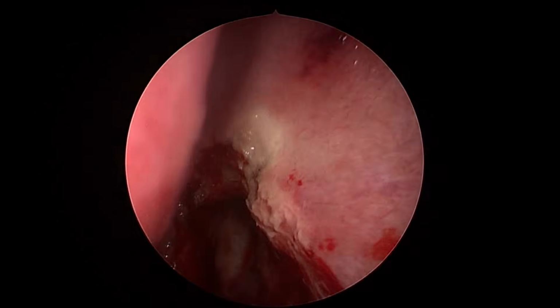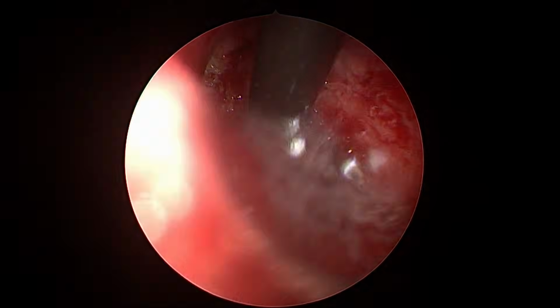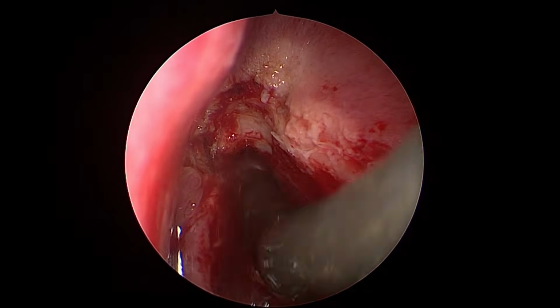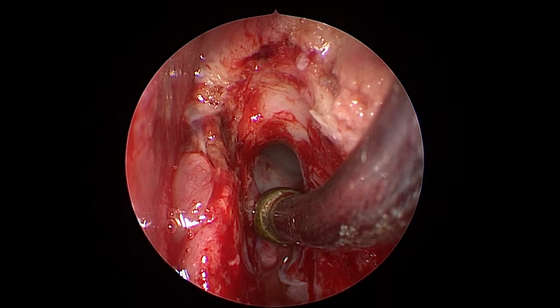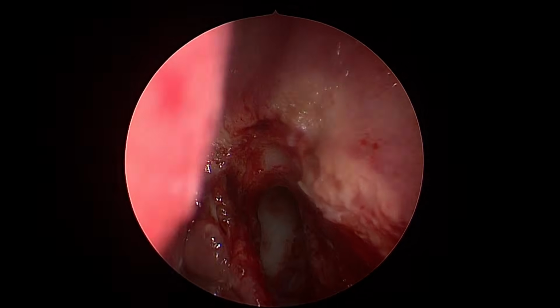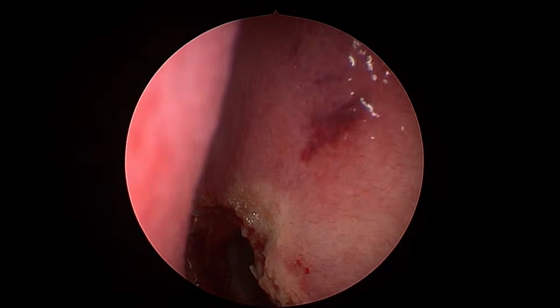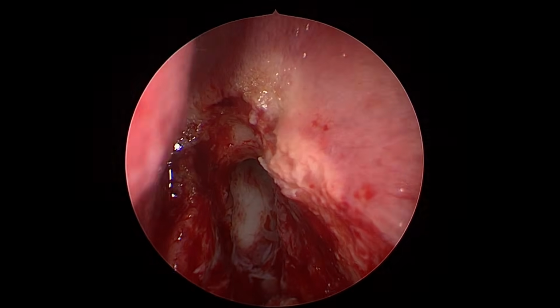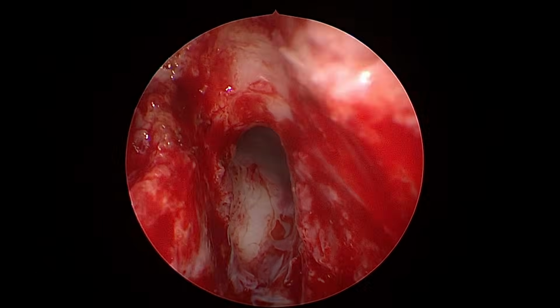It was blocked. The previous surgeon didn't bother to touch the frontal. You see. And now once the steroid goes, this mucosa is bound to come back to normal. And see the kind of access we have given for the steroid. So judge yourself, first of all, whether you have given adequate access or not. No one else is a better judge than you. Got my point? A half-hearted, limited opening in the frontal is inviting more problems. See this? What an amazing frontal. I hope you are convinced.